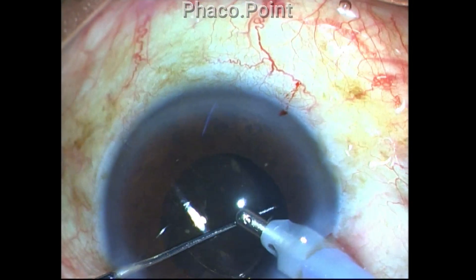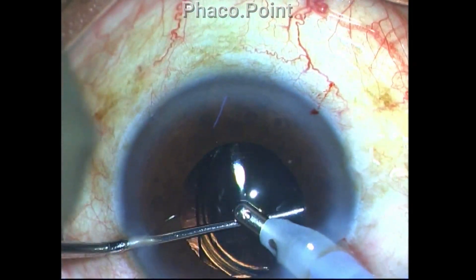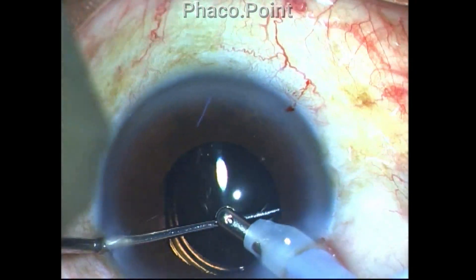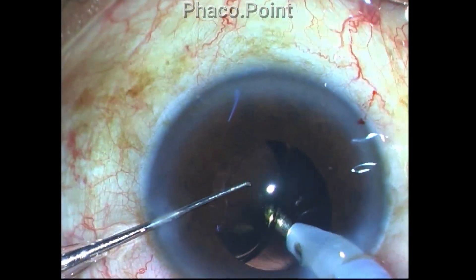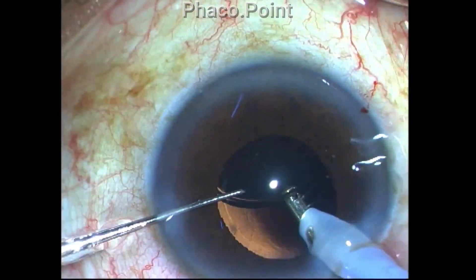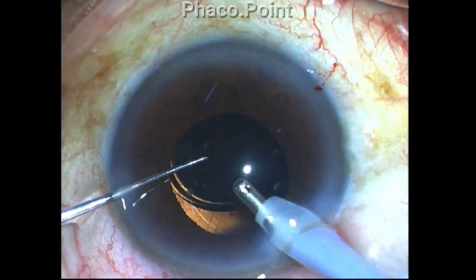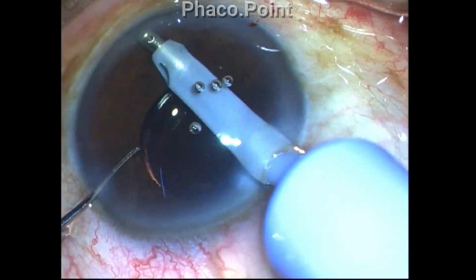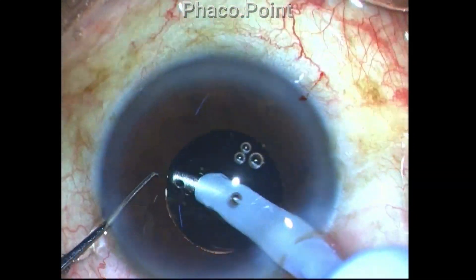I am not able to tilt the lens like I normally do in order to go behind it to remove the viscoelastic. However, I do it with a certain amount of difficulty. I can see that the posterior capsule is tending to rise up, so I quickly remove the viscoelastics and push the lens back into place, then remove the viscoelastic thoroughly from the anterior chamber.